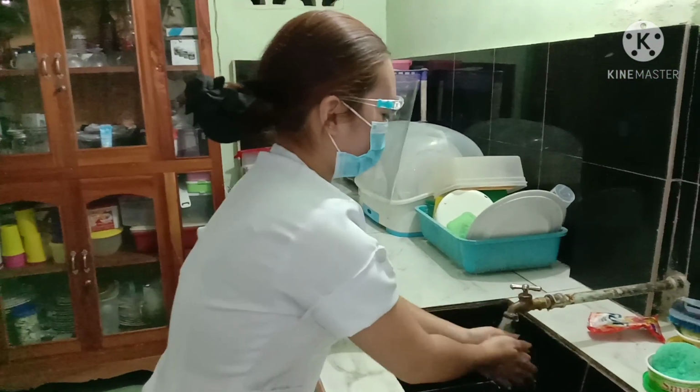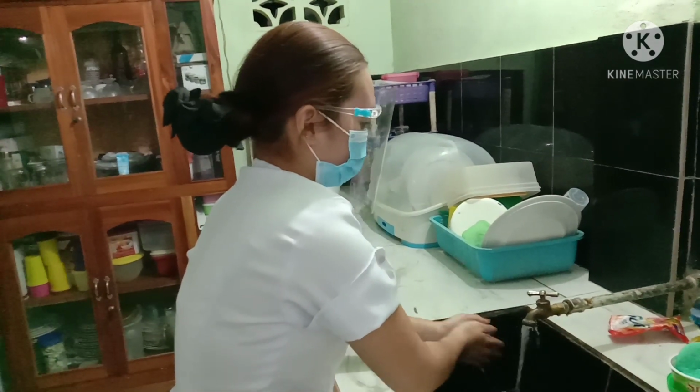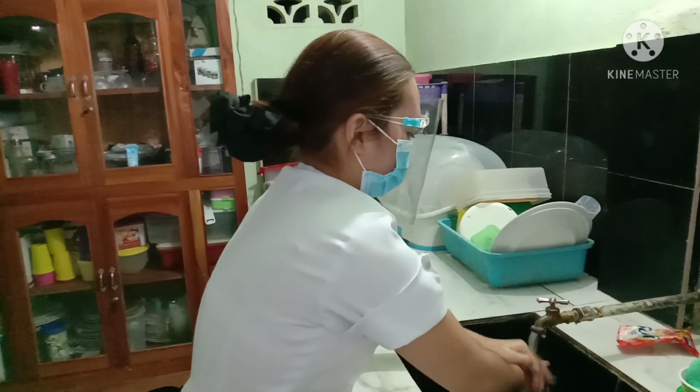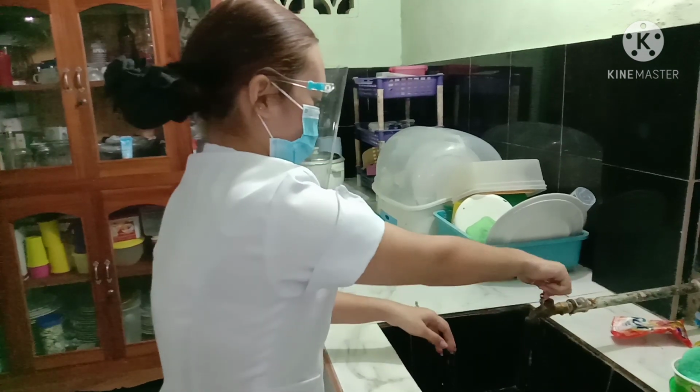Step 3. Perform hand hygiene to prevent the spread of microorganisms. Step 4. Place medication on a tray or move the medication cart outside the patient's room or prepare for administration in the medication area. Organization facilitates error-free administration and saves time.